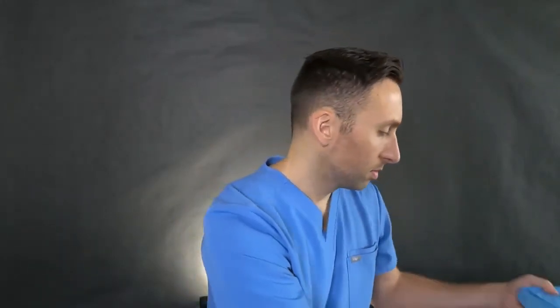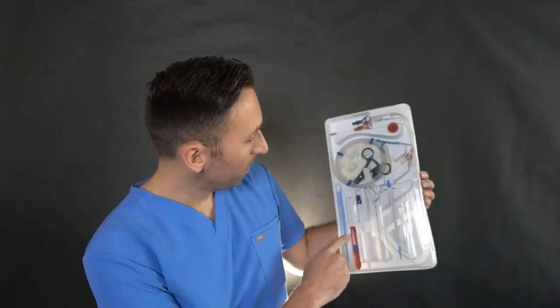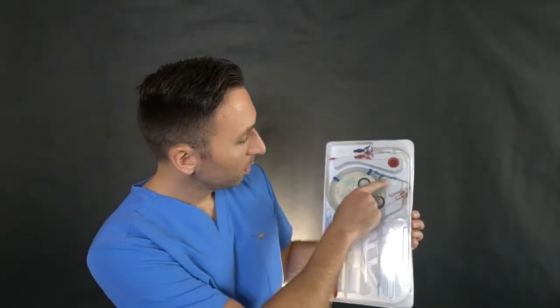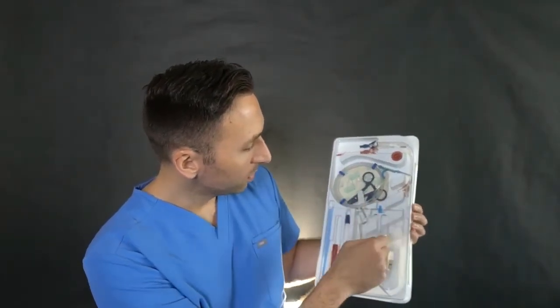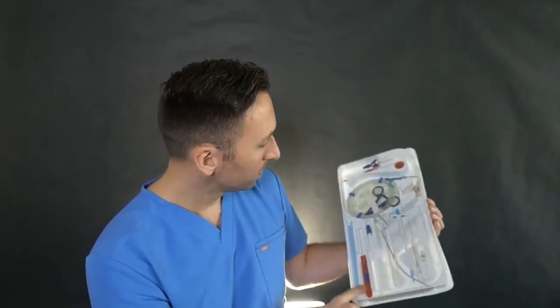Let's open this thing up — this is going to be loud. The tech would open the sterile cover and dump this on the field. Let me show you what's inside. So we have the catheter up here, our guide wire, a clip which we don't need, our tunneler, and our sheath and dilators as well.